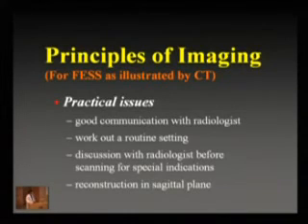You should always have good communication with your radiologist. If they vary their techniques, if you have many radiologists in the hospital that do scans for you, and you don't know what particular cuts they are going to use, sometimes it may be less useful than you want because it is not being done the way you want. You should work out a routine that you would stick to. Even though there may be many radiologists working in the hospital, if you can have an agreement with the radiologist in charge, then all the radiologists can use the same setting, and that will make it easier for you to interpret your CT scans.